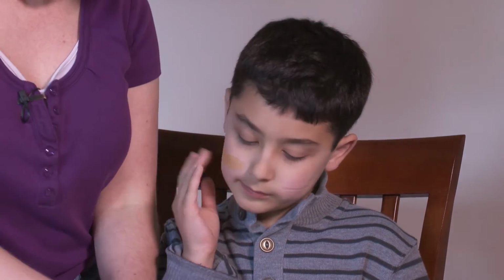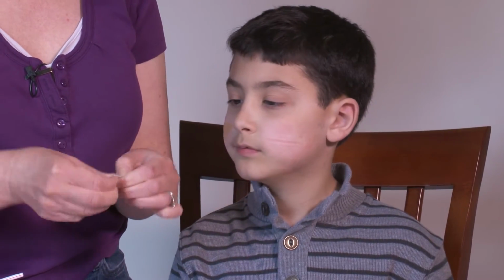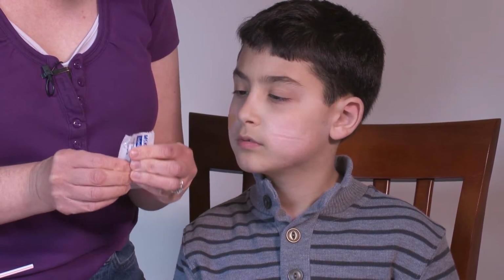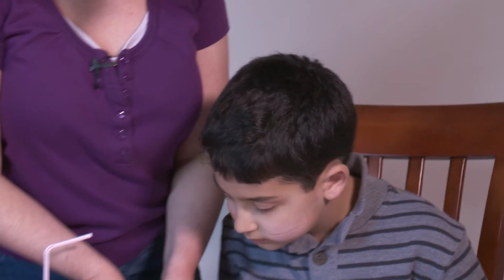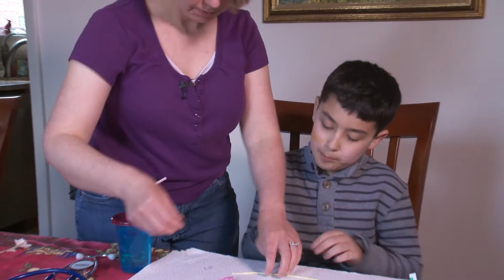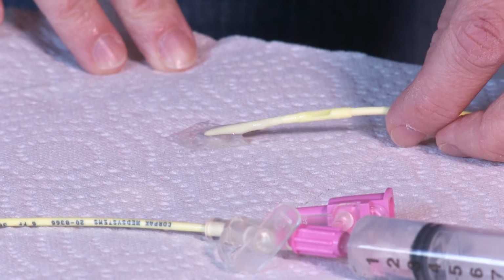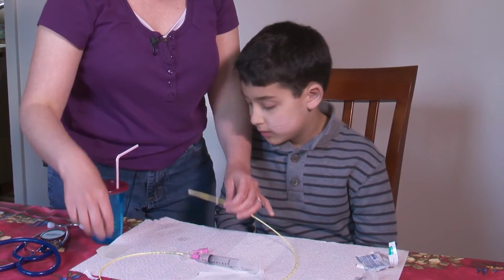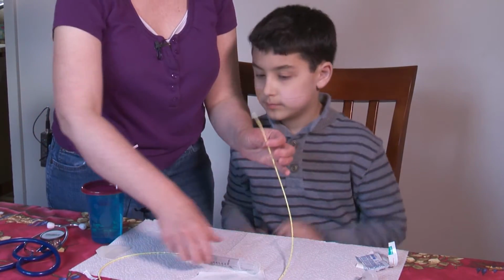Okay. And we're going to put a little puddle of KY jelly here. So that you can refresh the KY anytime you need to. That's right, that's true, because sometimes if we take a false start, we end up needing a little bit again.